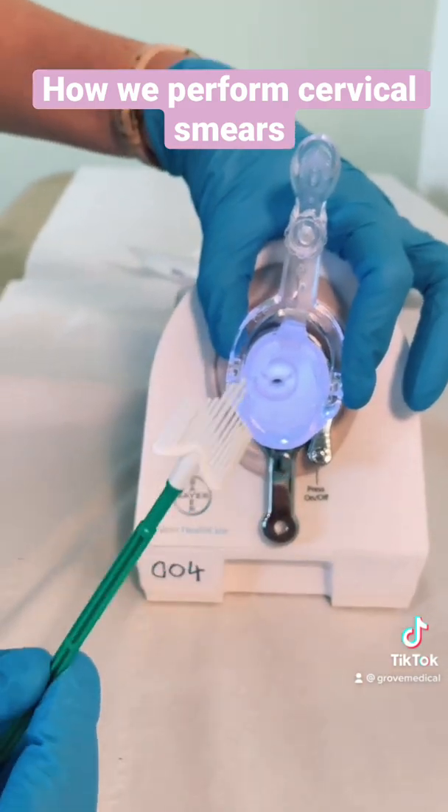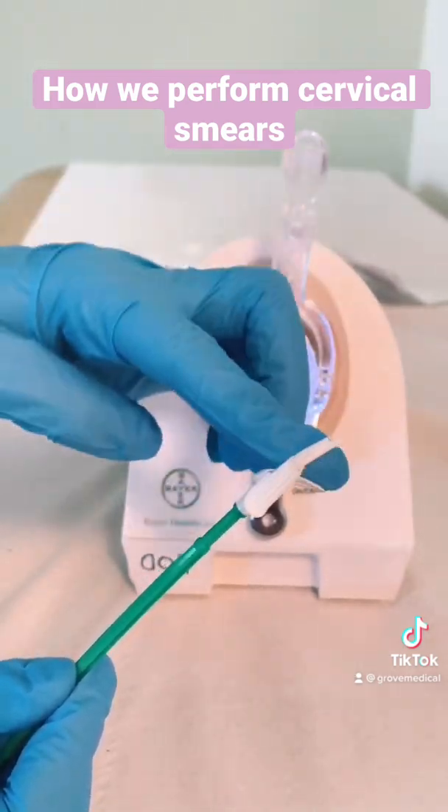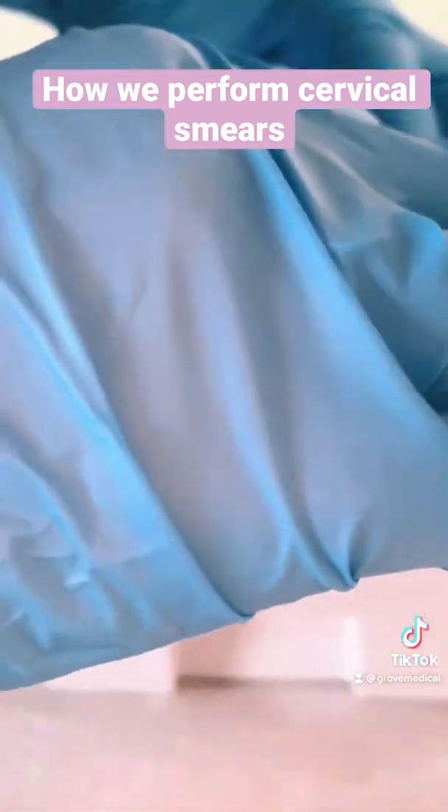Then I take this, which is pretty flexible as you can see. This is used to sample some of the cells — get the right spot and turn it around five times.